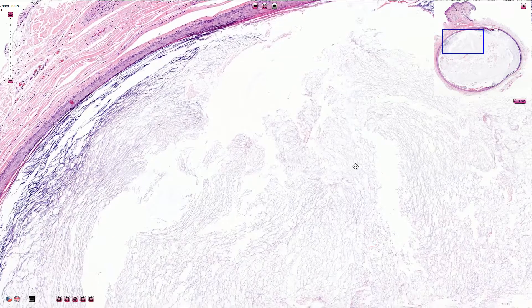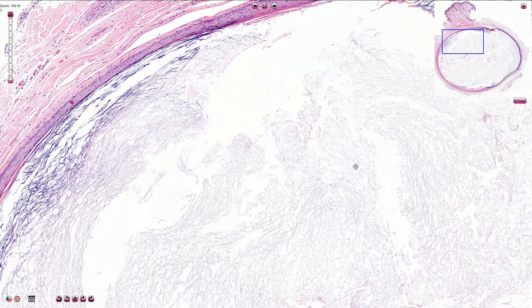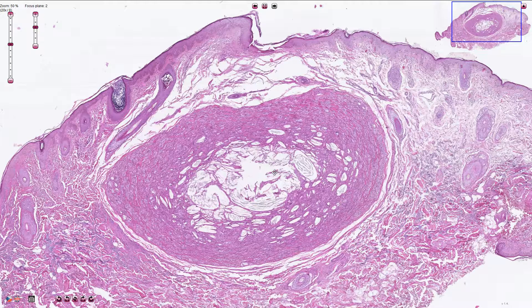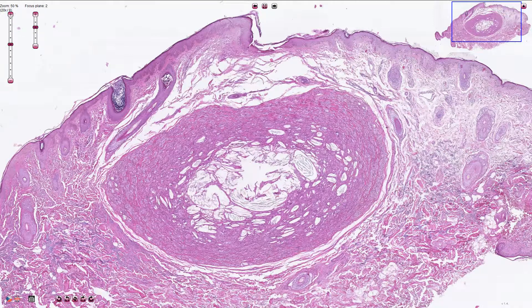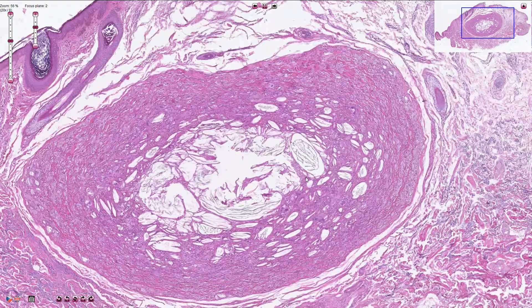The cyst can be connected to the surface; however, some cases associated with traumatic etiology can be without surface connection. In some cases the epidermal inclusion cyst can rupture, and then we can see a chronic inflammatory reaction around the foreign body material, as seen here in the second slide.